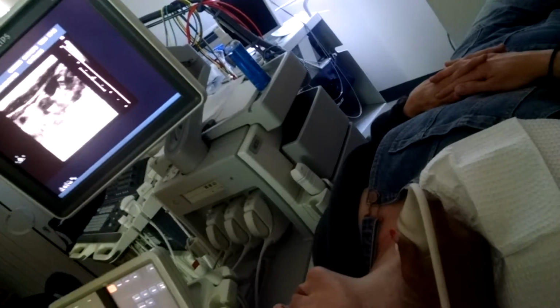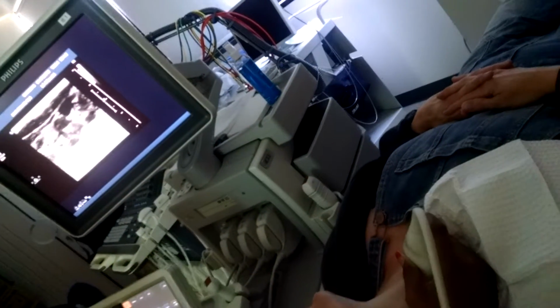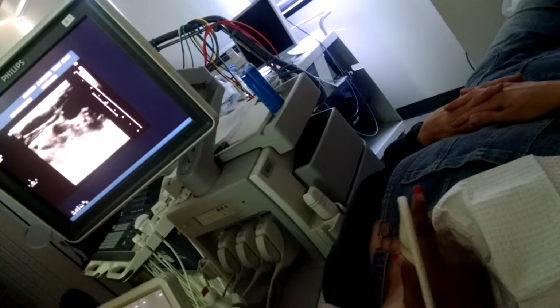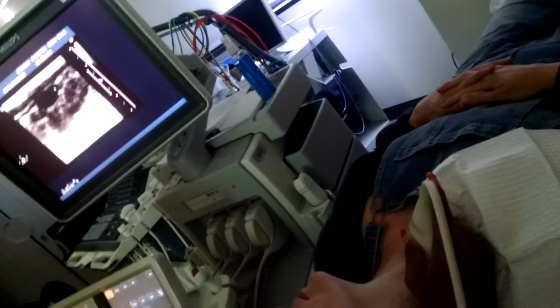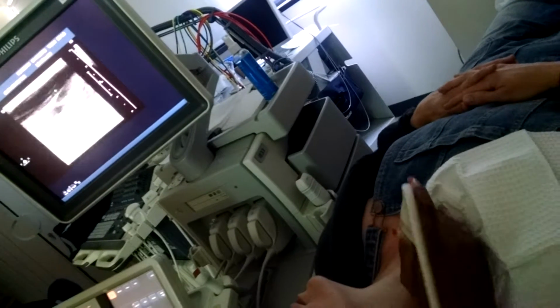So I'm going to start here. I'm going to put that in the middle so I have my, let's see if I can find a caliper. I have my common and I have my jugular. See how the common's not very clean right there? So I can try to move around if I want. I want to keep good contact. That's not good contact right there. It's jelly.